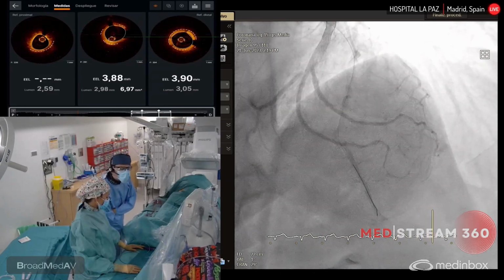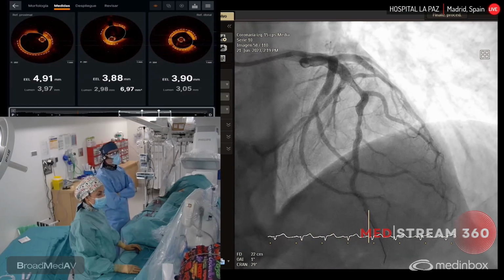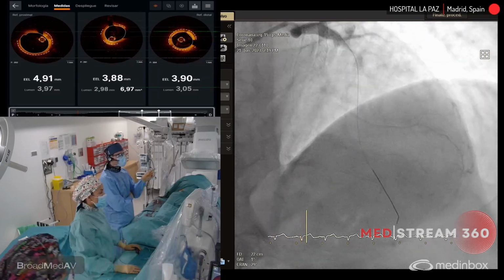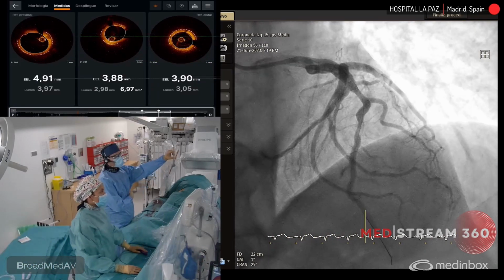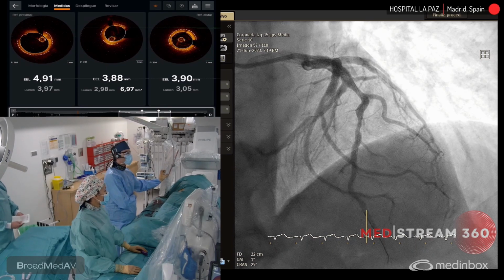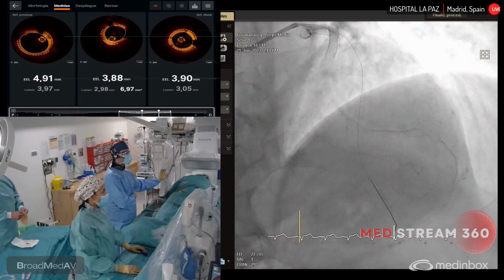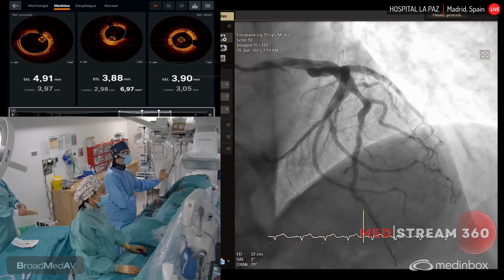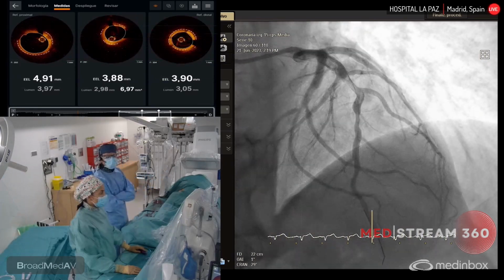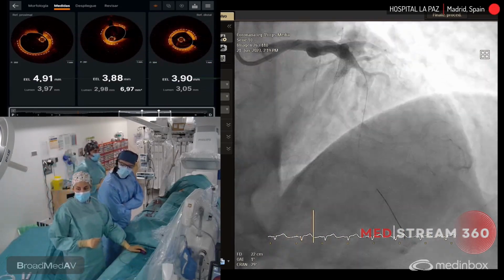You can see in the proximal part there is still lipid plaque, so we need to go more proximal to this point, about 20. Now, seeing at the same time the OCT and also the angio, probably we have enough space to land and be comfortable of landing in a healthy zone. Probably Santi is right, and 24 or something like that could be nice. So we are implanting a 3.5 by 24.